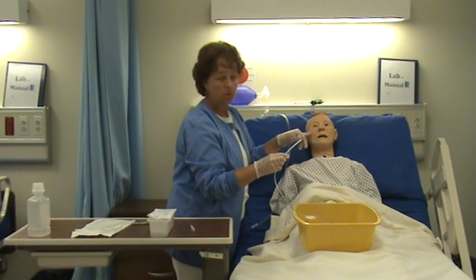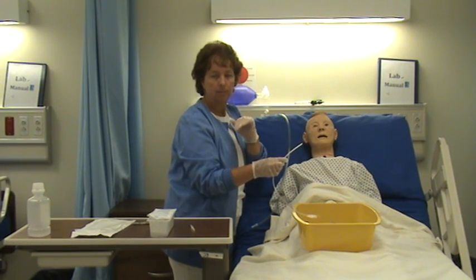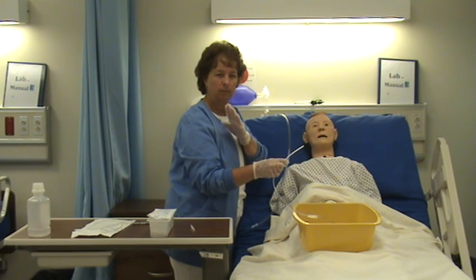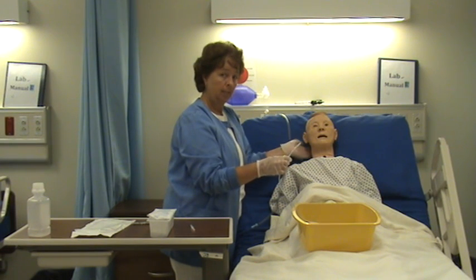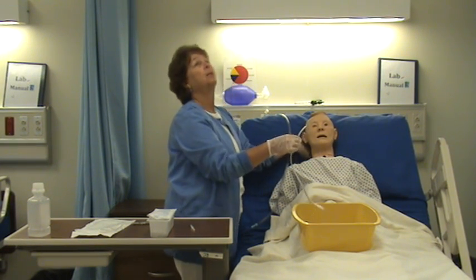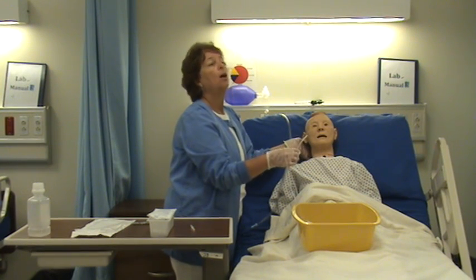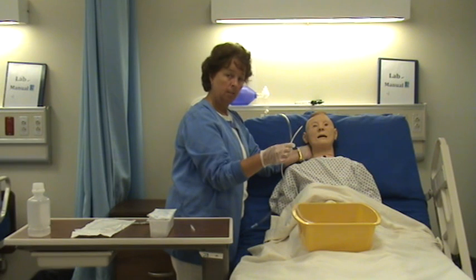I'm going to assess which nostril to use — ask the patient if he has a deviated septum and which side is more clear. I like to put my hand behind the back of his head, because when you start going up his nose he wants to tilt back, and you want to close the airway rather than open it, so you're not putting the tube into the airway.